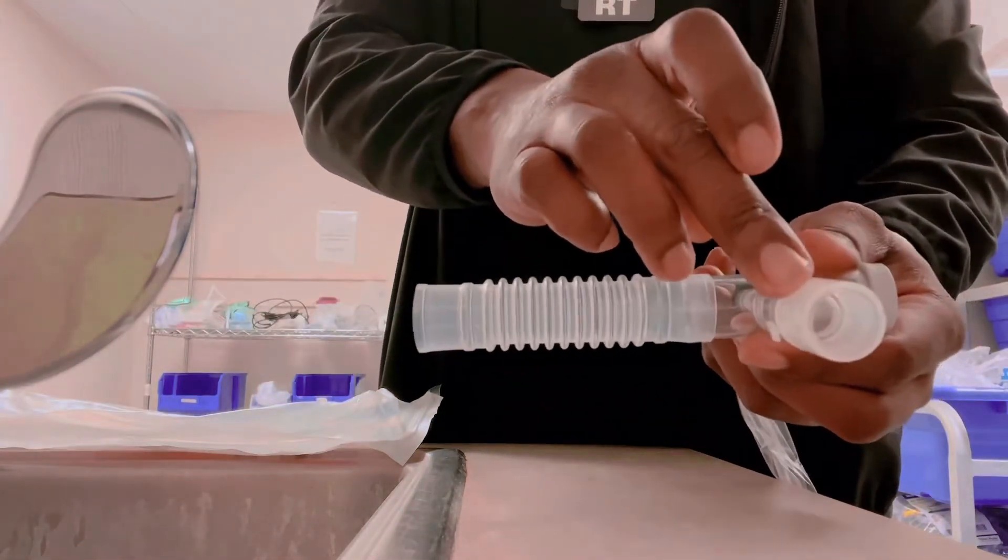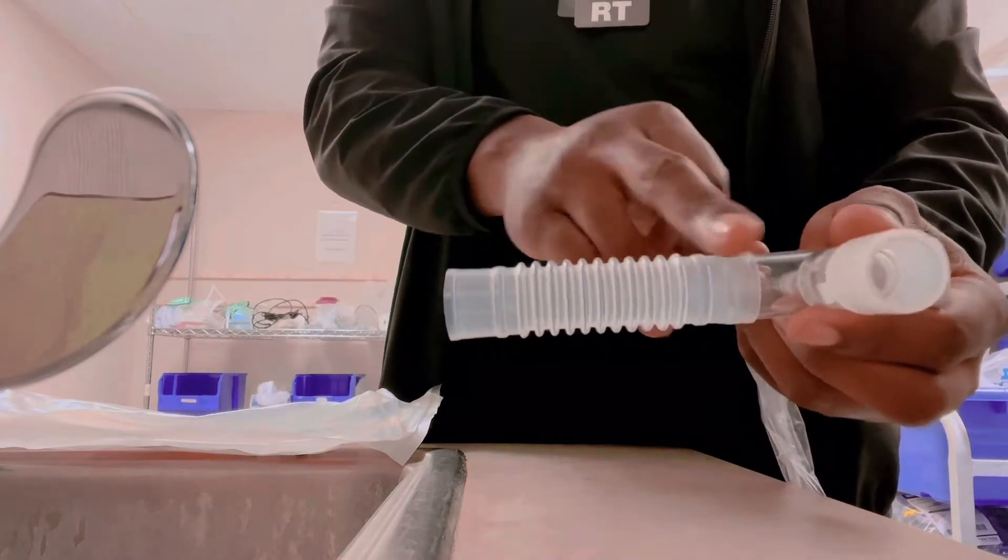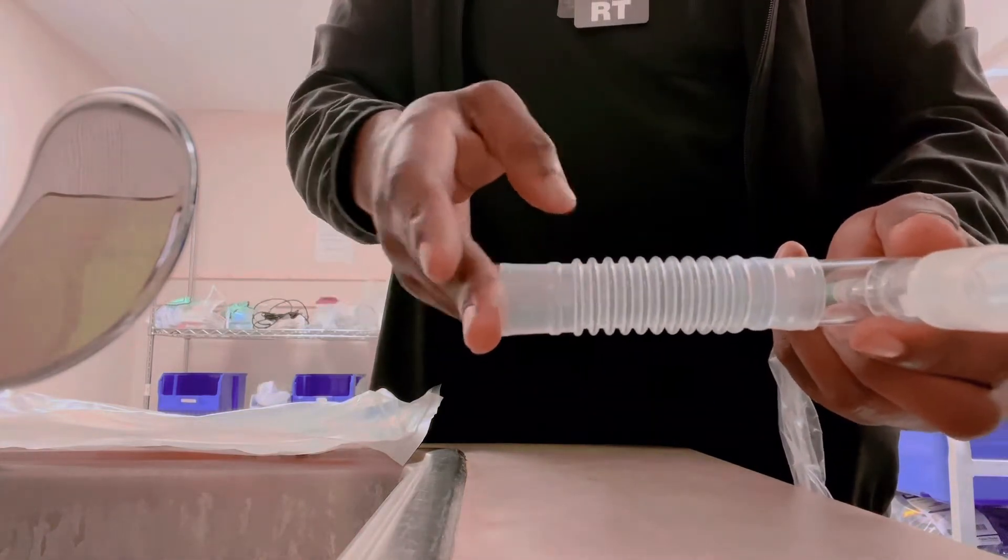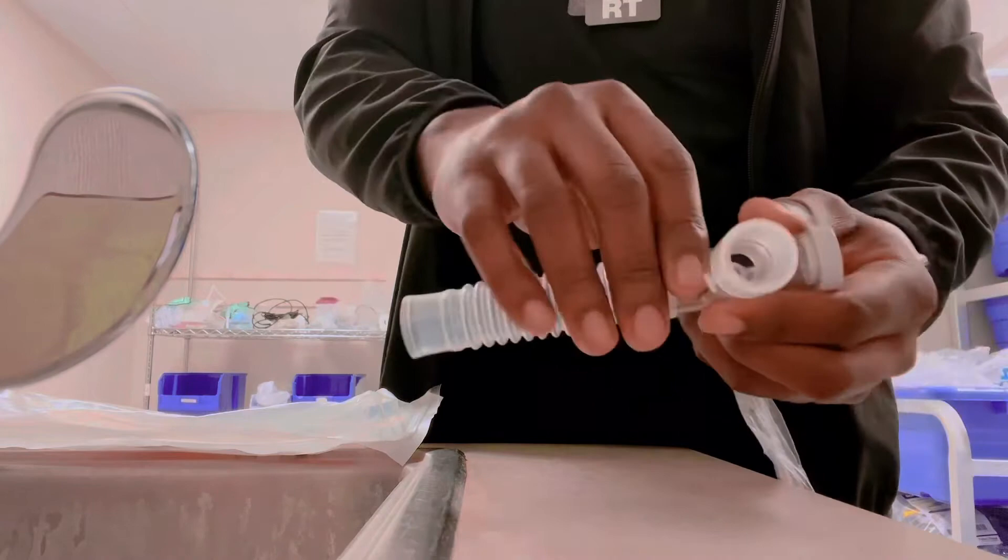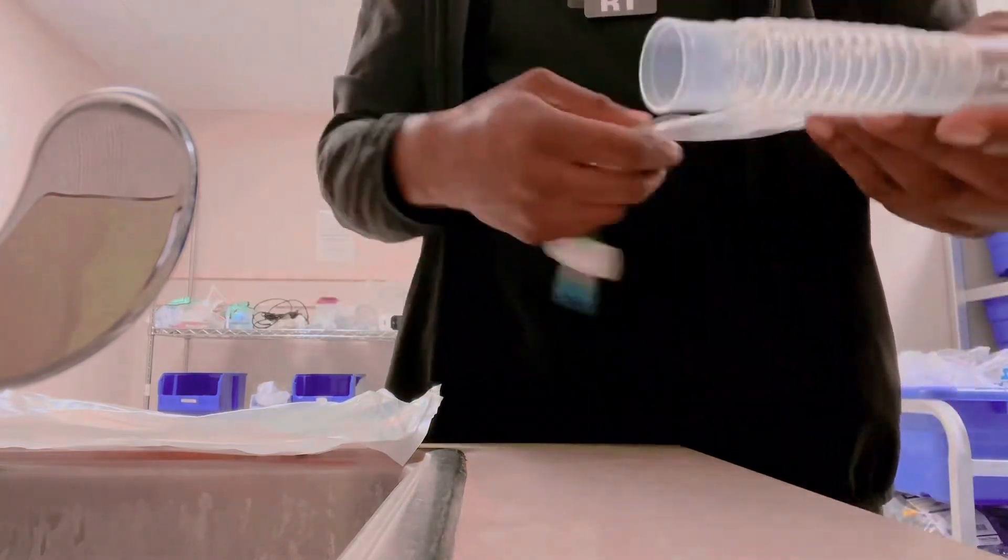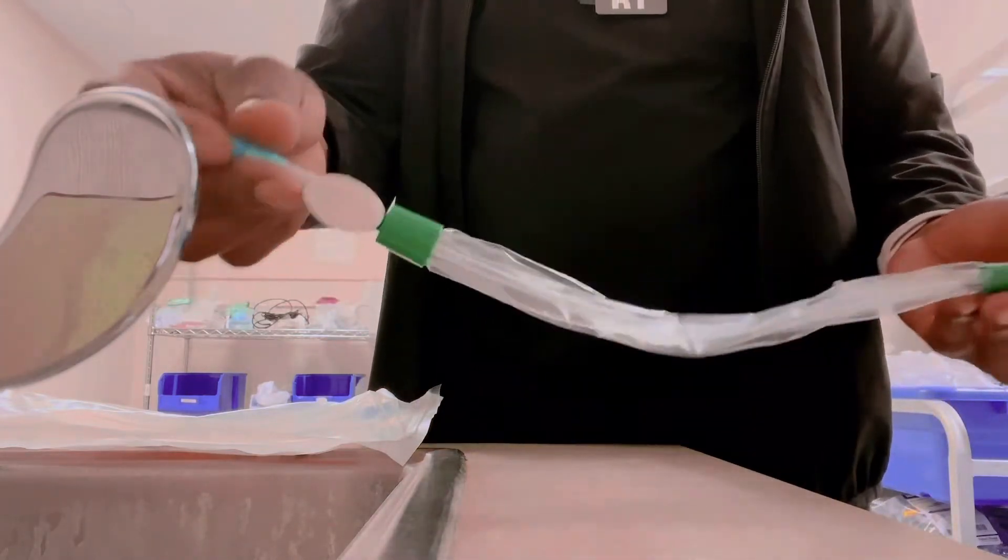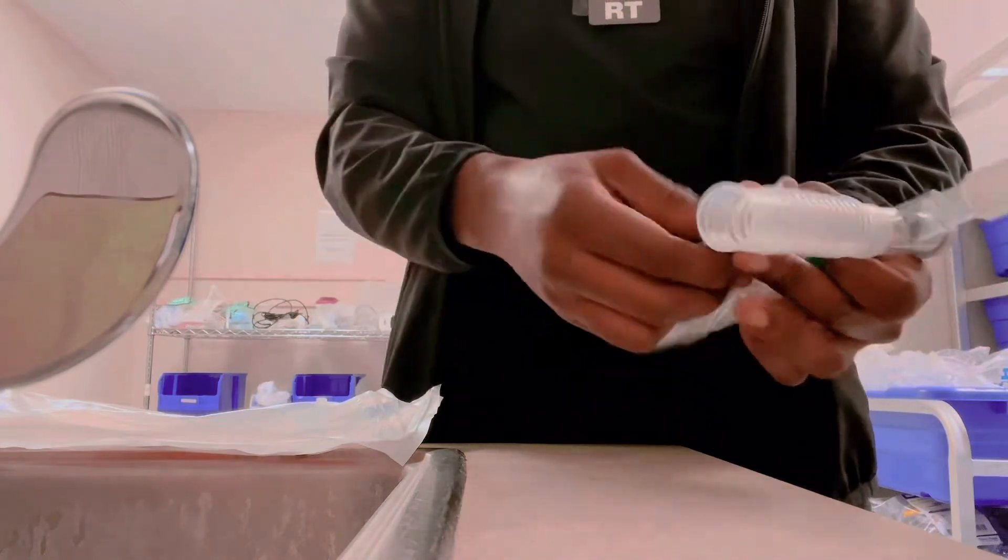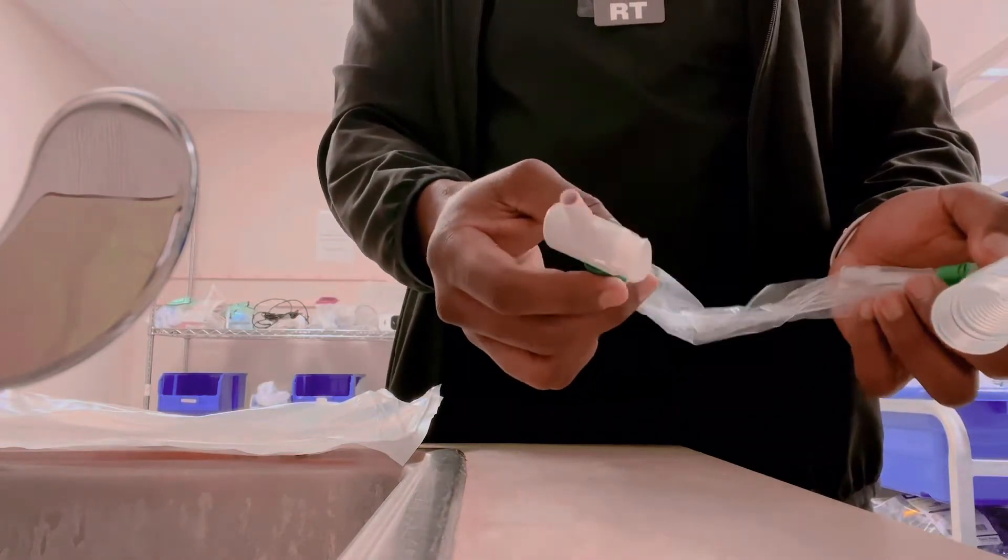This end goes to the tracheostomy tube directly to the patient. This goes to the corrugated tubing, the wide bore tubing to the patient. This goes to our vacuum suction. This piece wouldn't normally be here, but this would be connected to our vacuum suctioning.